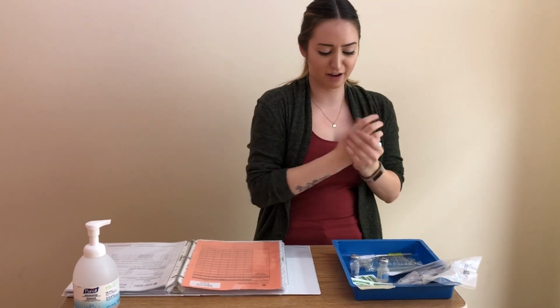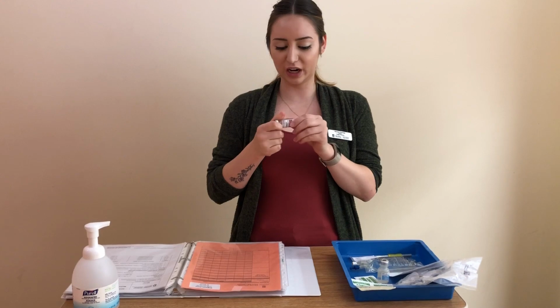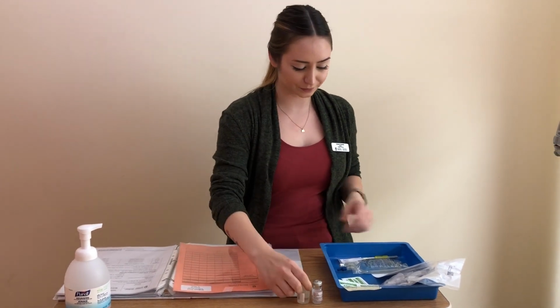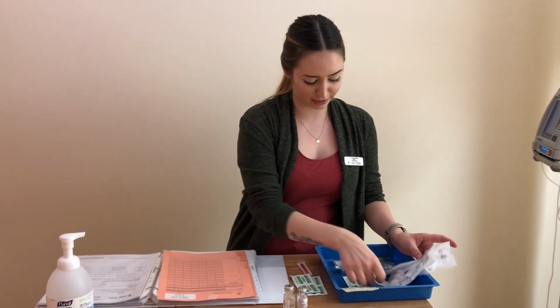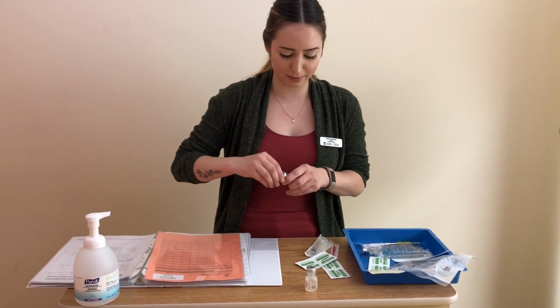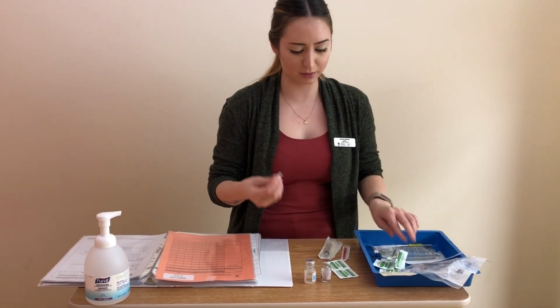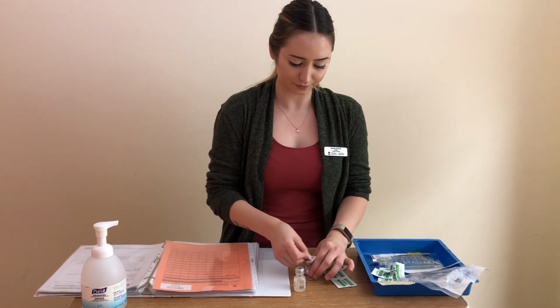So, I have my vial of drug here, methylprednisolone. It's not expired and it can be given via the IV route. So I got that there. I've got my sterile water, some alcohol swabs, and my blunt fill needle, my syringe. So I'm going to begin by removing the caps on my vials, and I will swab the tops of each vial for 30 seconds and let them dry for 15.